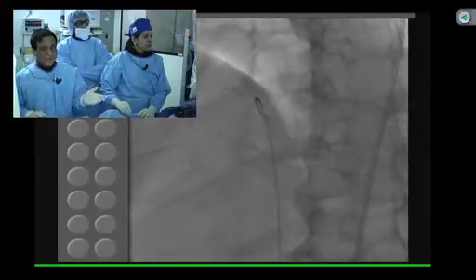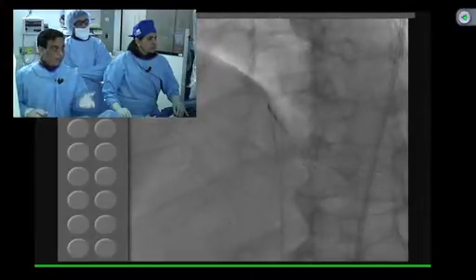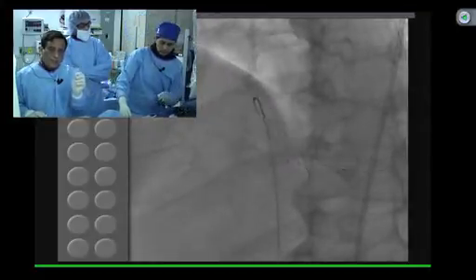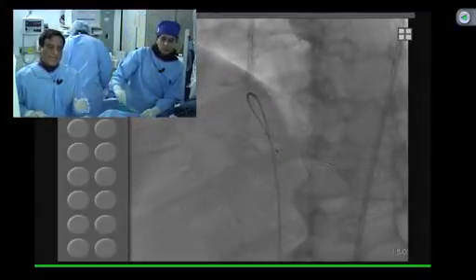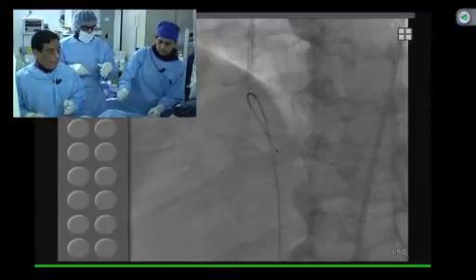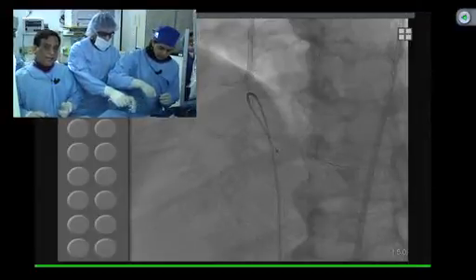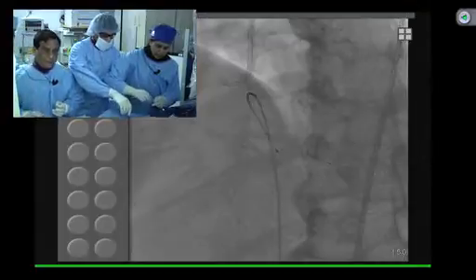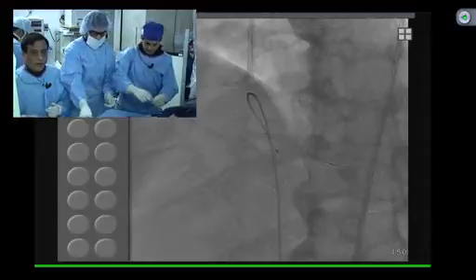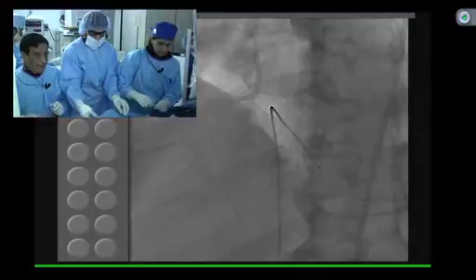Now the data basically look at the difference between high pressure PTCA versus atherectomy or the cutting balloon or AngioSculpt, and the answer is very simple. Basically, it just gives you a little better lumen, but more importantly, less slippage, so that now you can have a better stent expansion and cause less dissection. Now, if your plan is to do restenting, then I don't know whether you really need this additional expensive gizmo, whatever the cost is, $650 to $800, of the cutting balloon or AngioSculpt. In those cases, just go to a very high pressure and restent.